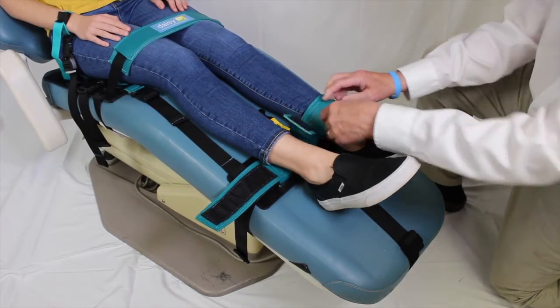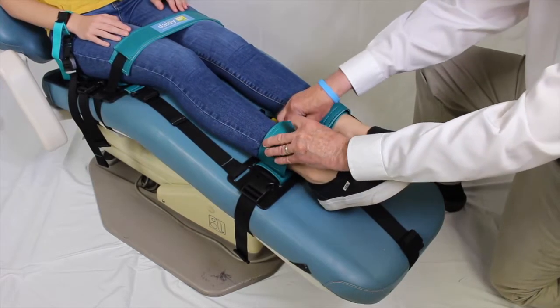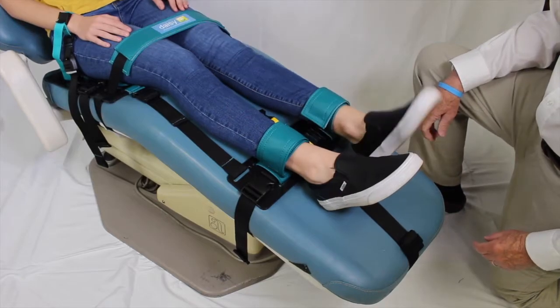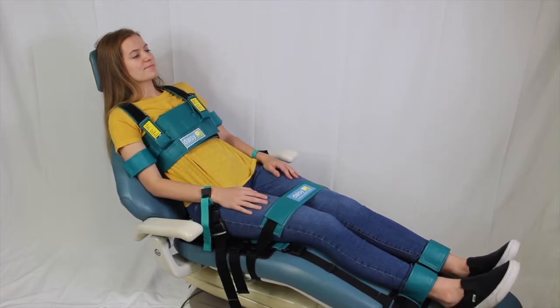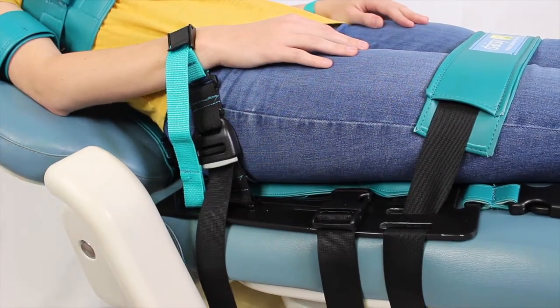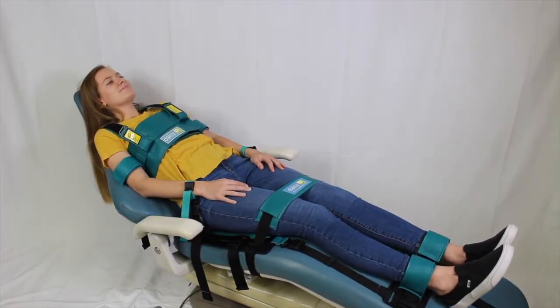Length and position of the leg straps are adjustable. They can be positioned to the desired length with a control strap between the seat base and leg strap base. The leg strap base should be positioned to the best fit of the patient's leg length. Once the patient is positioned in the DAISY PSR, you can adjust the dental chair to the desired position. The strap base design remains firmly attached to the dental chair during positioning of the patient.